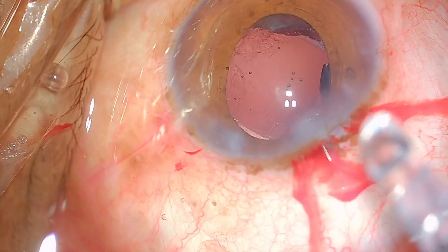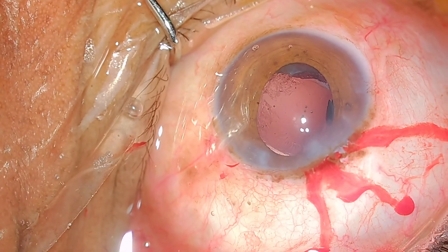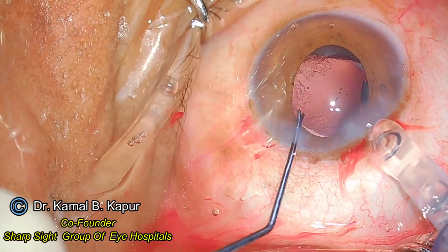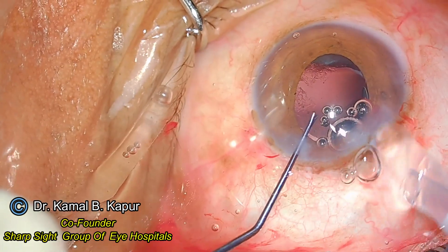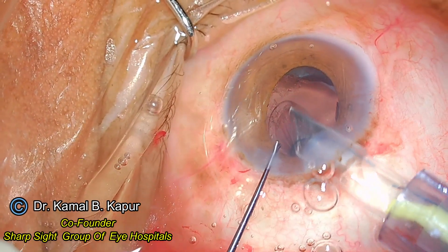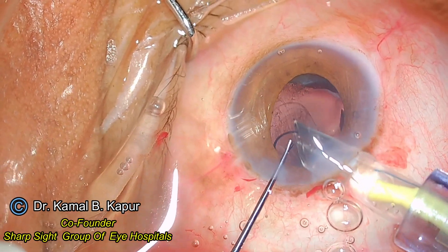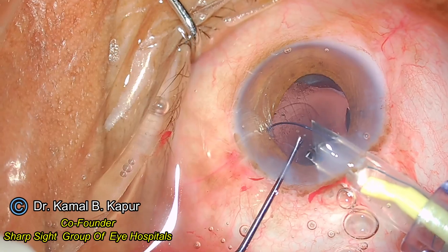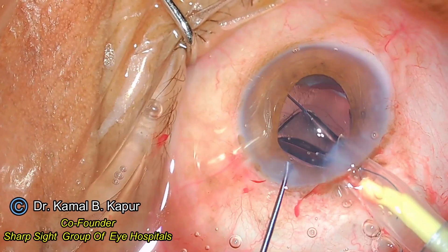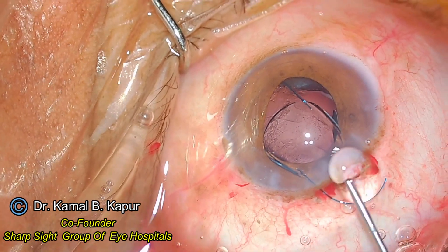The trick with this cartridge injector is: I insert the cartridge facing the left side, push the haptic, and make sure the haptic goes behind the iris and on top of the anterior capsule. Notice the left tilt of my phaco tip, and as the haptic is coming out I insert it just behind the IOL using my left instrument as a guide.